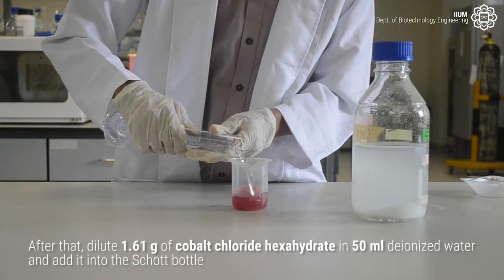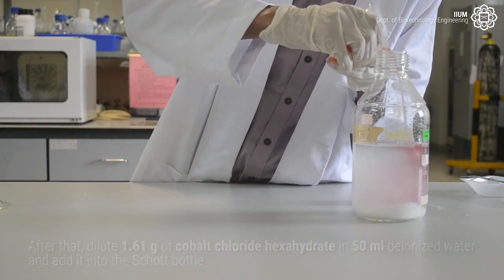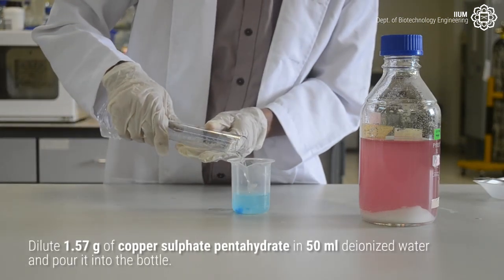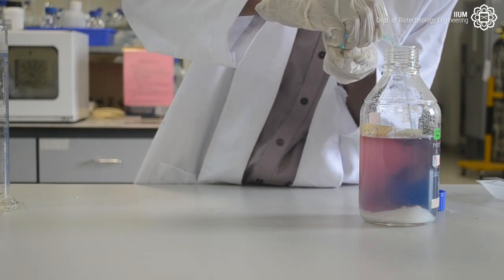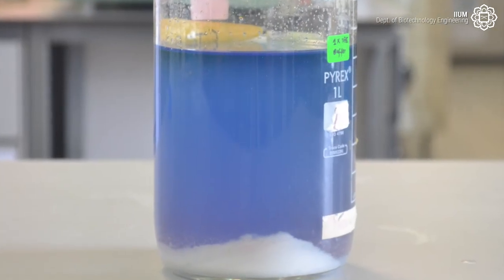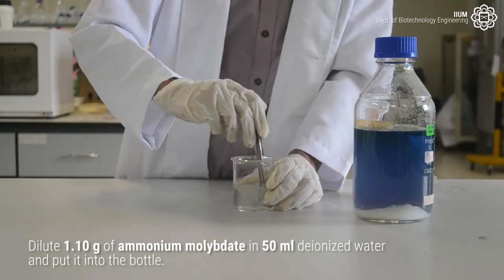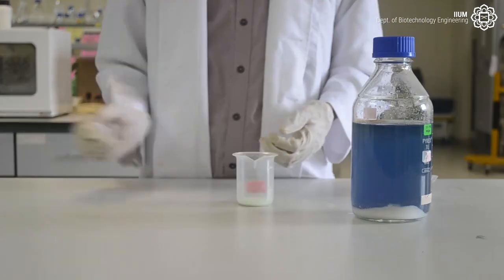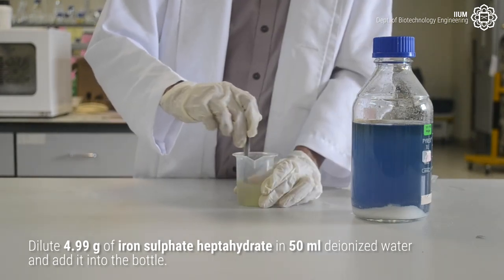After that, dilute 1.61 grams of cobalt chloride hexahydrate in 50 milliliters of deionized water and add it into the bottle. Dilute 1.57 grams of copper sulfate pentahydrate in 50 milliliters of deionized water and pour it into the bottle. Dilute 1.10 grams of ammonium molybdate in 50 milliliters of deionized water and put it into the bottle. Lastly, dilute 4.99 grams of iron sulfate heptahydrate in 50 milliliters of deionized water and add it into the bottle.